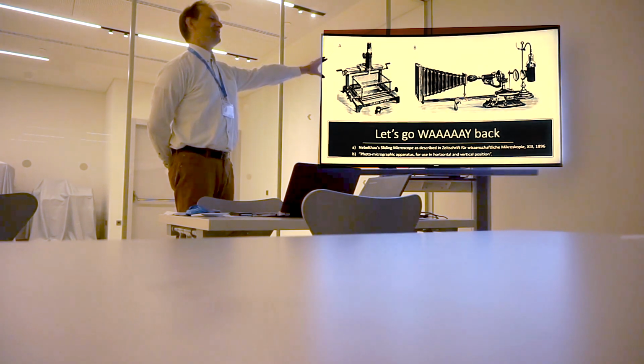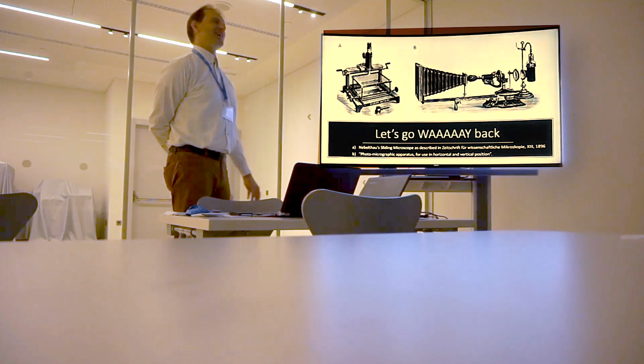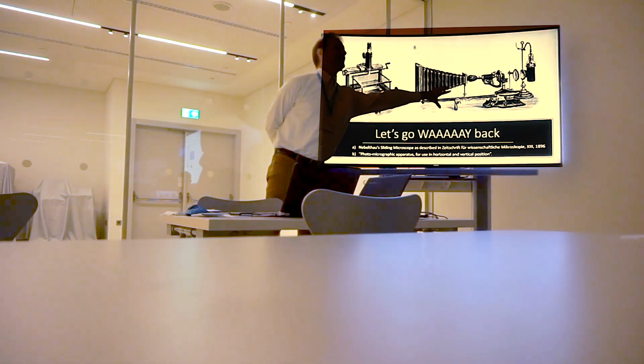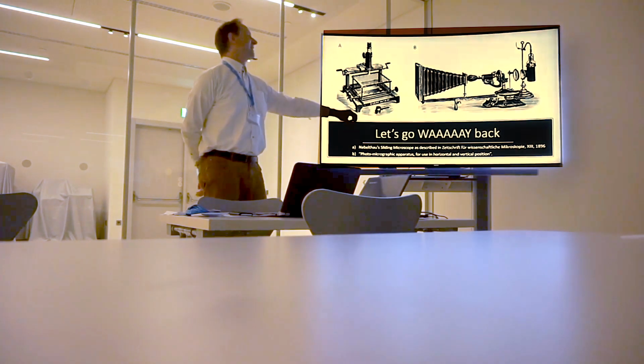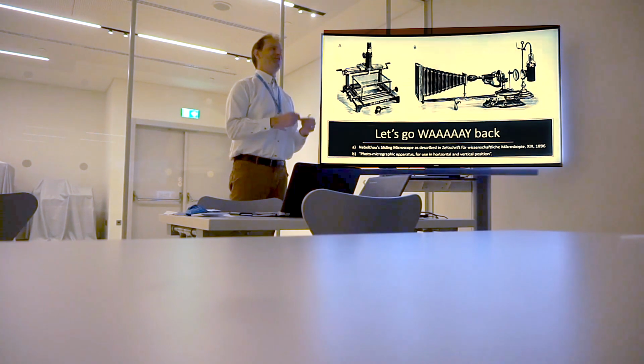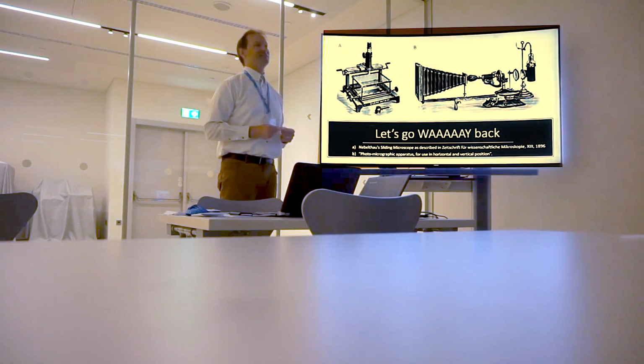These images go back to the end of the 19th century, when people had already been thinking about how we are going to capture microscopy data on one hand, and then how we can systematically move the field of view in very small, infinitesimal, incremental stages.